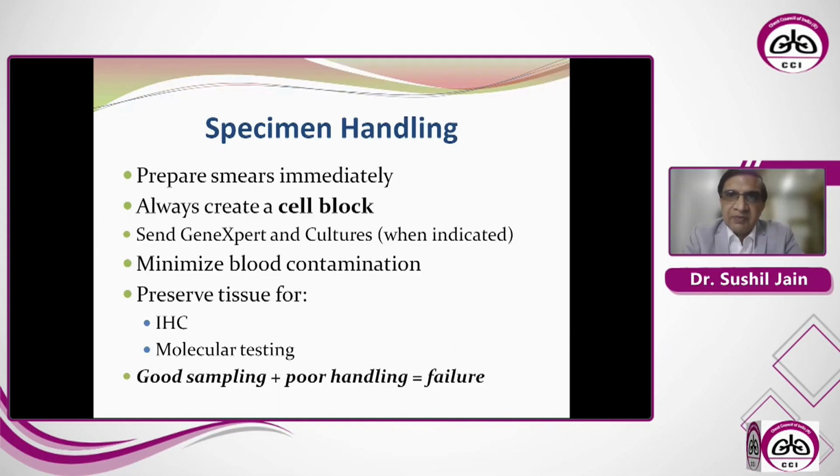If you have taken a sample properly, but you don't handle the tissue properly, then the diagnostic yield may still not be there. So make sure that good sampling is very, very important, but proper handling is also essential, because poor handling can lead to failure of your diagnosis, the failure of your procedure.